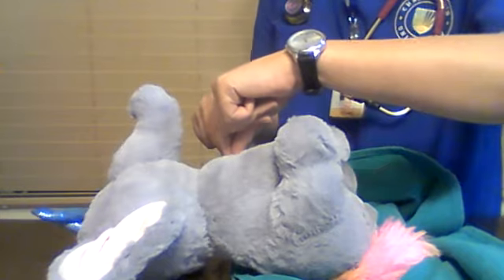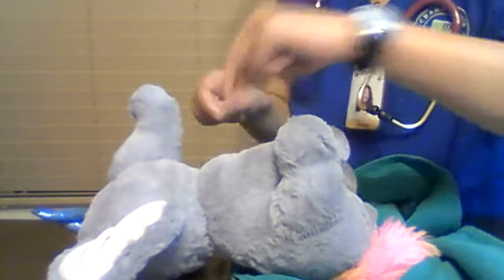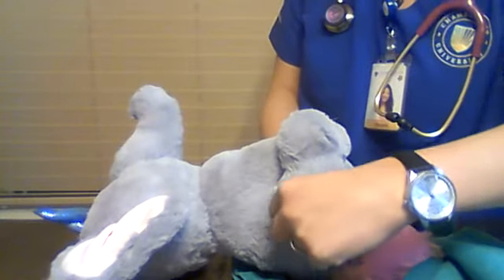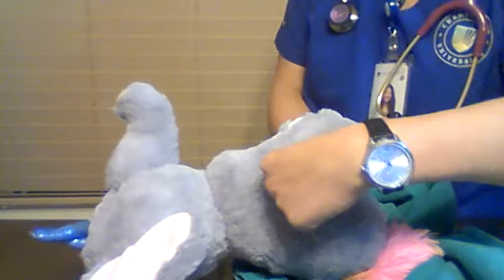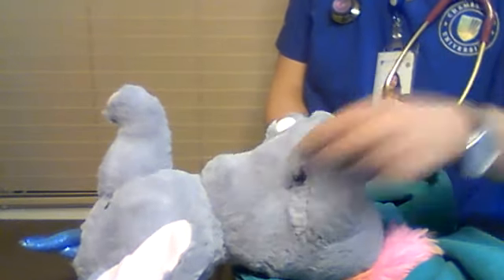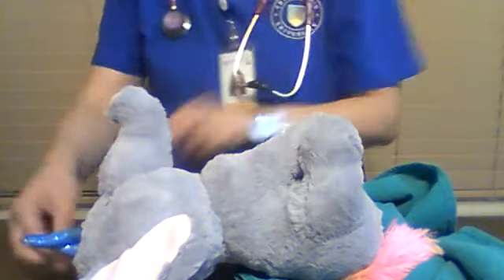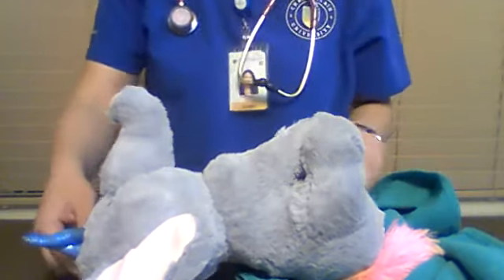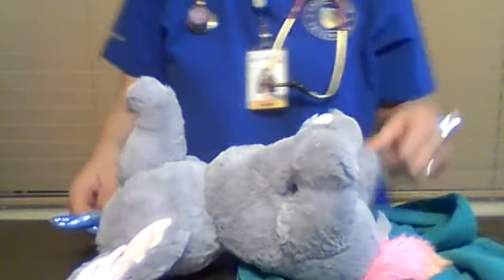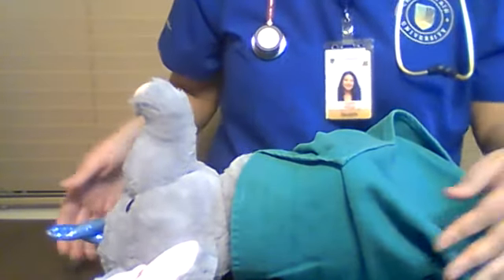That should be about 2 centimeters less than the head. Then I will go ahead and do the abdomen as well, and it's going to be below the umbilical cord. I will measure that, and then I will measure from the crown of the head and extend the leg out so that I have a full length to get the length of the infant.